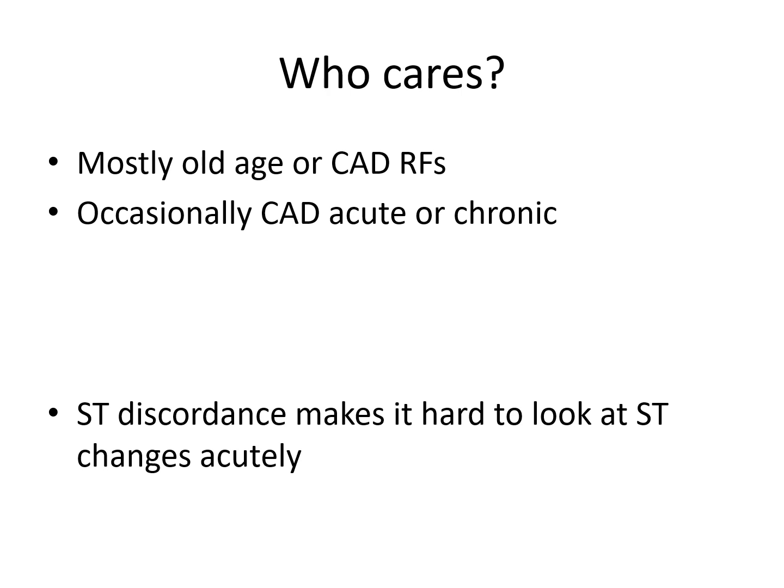So in the previous iteration of the American Heart Association guidelines, a new left bundle in the presence of chest pain was considered to be a STEMI equivalent. This has been taken out of the latest iteration because it has in fact been shown that a very small minority, less than 1 in 6, of new bundles, quote unquote, in the presence of chest pain ended up being significant occlusions, and the commonest reason for a new left bundle is simply the fact that somebody hasn't had an EKG for a while.